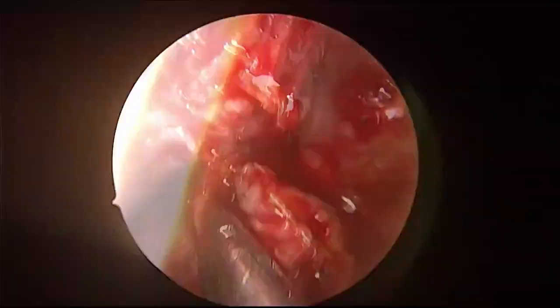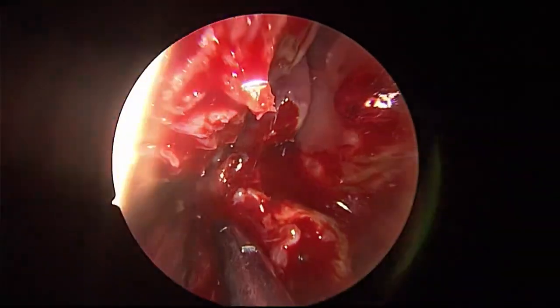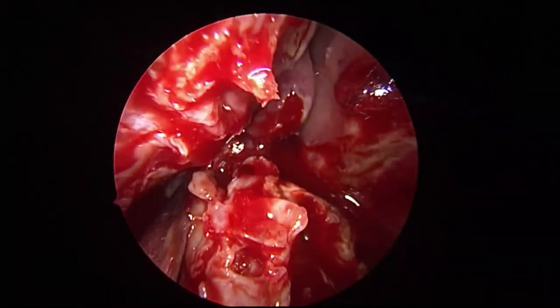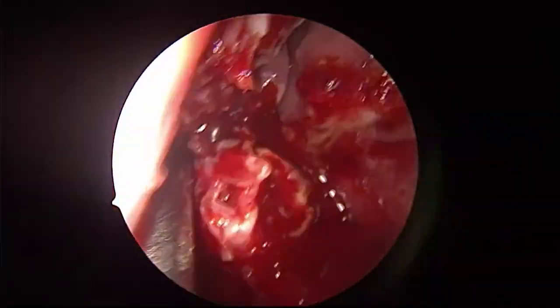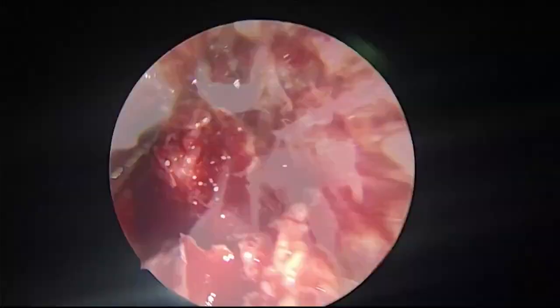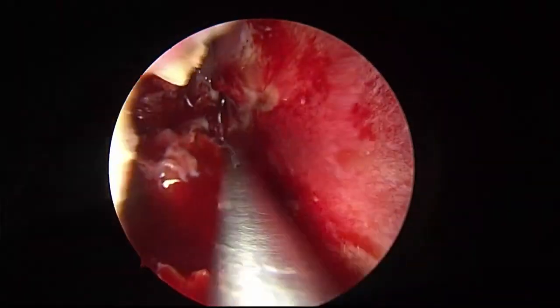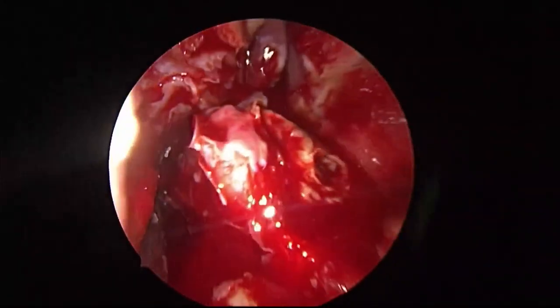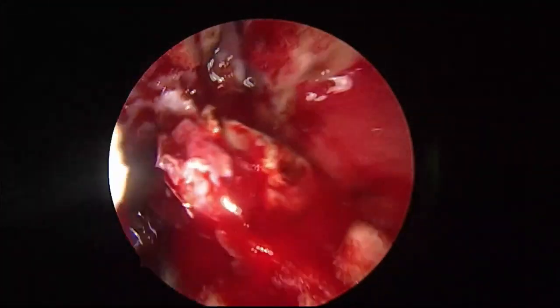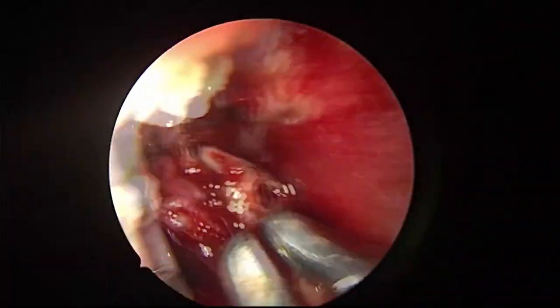See above where my duct is. Let me press in the lacrimal region. Can you see? See this above? So this will no longer interfere with our further work. I hope you got my point. Cut flush. See now, the area is very clear. No duct is going to come in between.